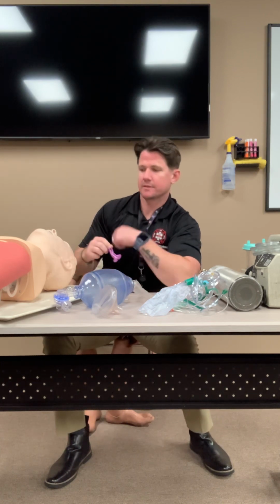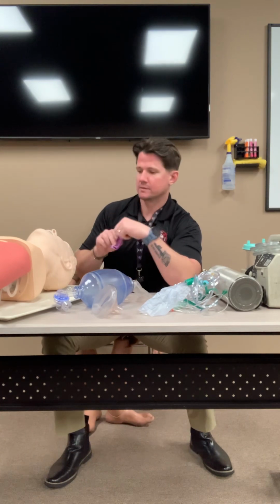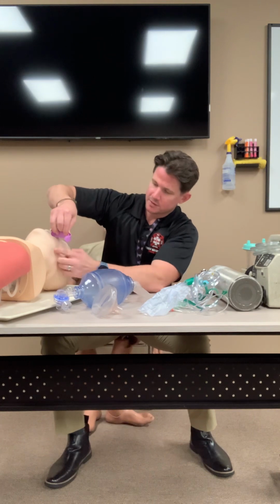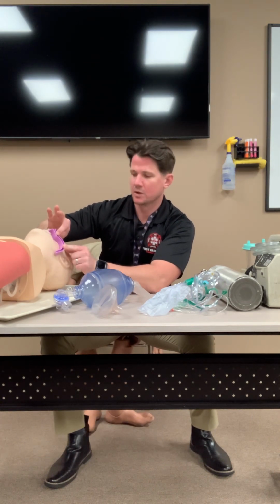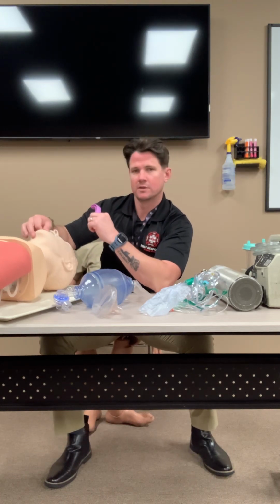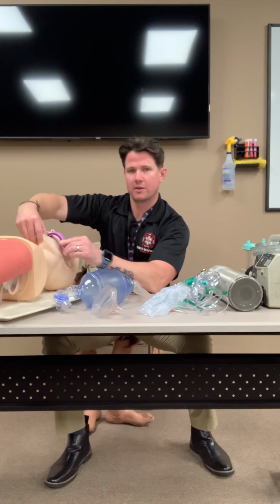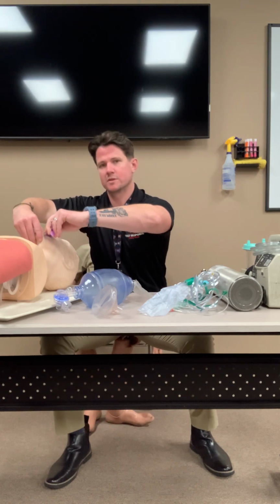Proper insertion technique at a 90-degree angle. Well, before that, we need to measure it, right? The appropriate measurement technique is from the corner of the mouth to the angle of the jaw, or the mandible, right? Once we've done that, appropriate insertion technique: open the patient's mouth using a scissor technique, or you can just grab the patient's tongue, take the OPA in the corner of the mouth.